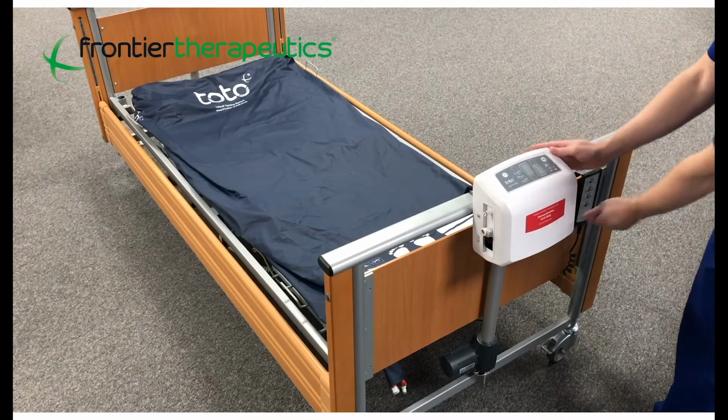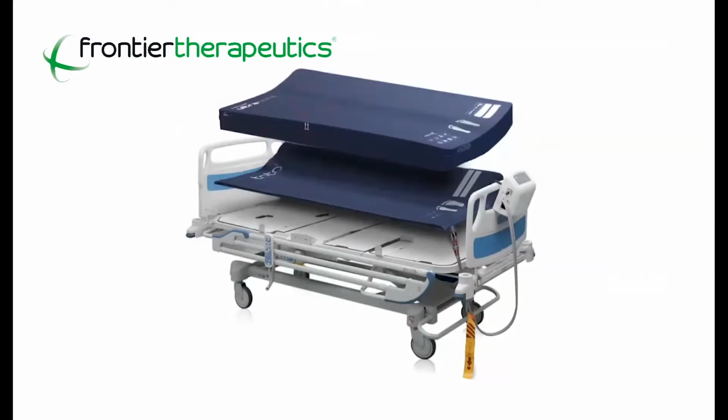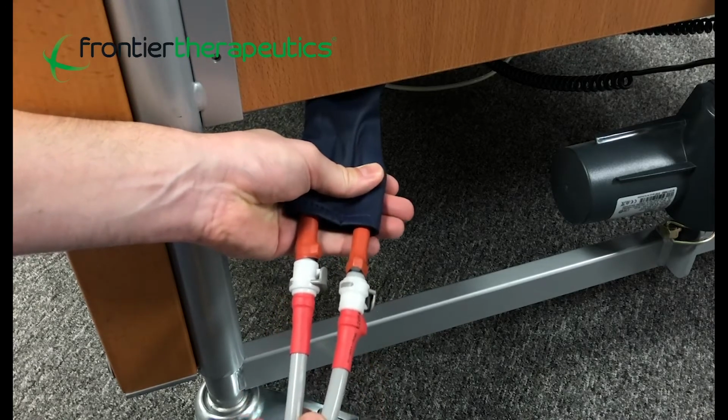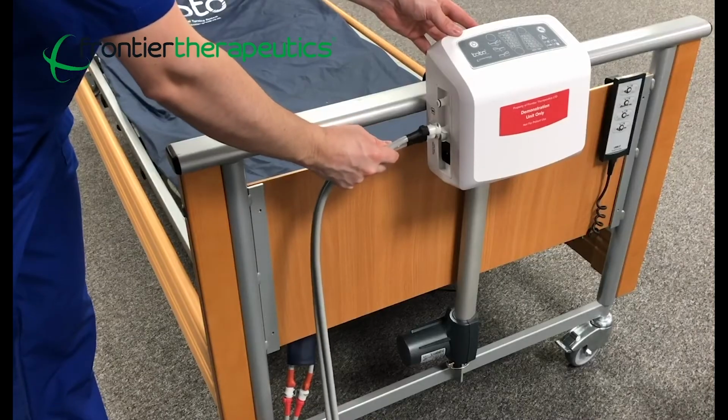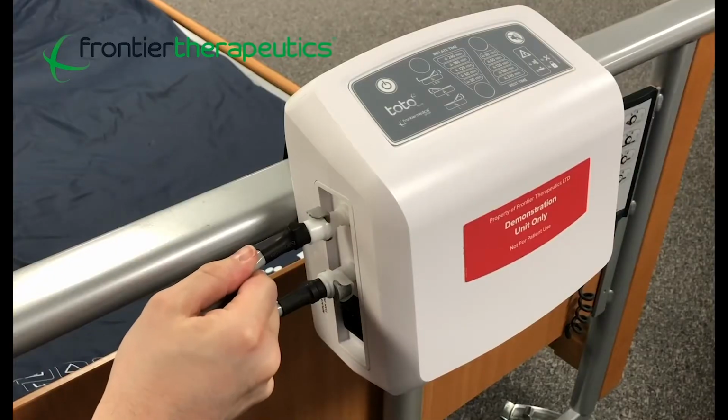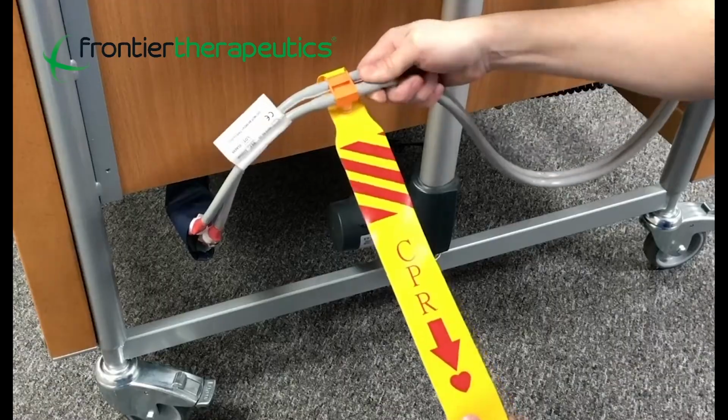The automatic setting is usually 2 hours, so it would inflate, do the 30-degree turn, keep that patient in position for 2 hours, deflate, inflate on the other side, so you get a full 30-degree turn on the opposite side, and then deflate, allow them to lay supine for the 2 hours. So you get supine and a left and a right turn for 2 hours essentially, without having to physically go in and turn the patient. I'm sure your staff love that.